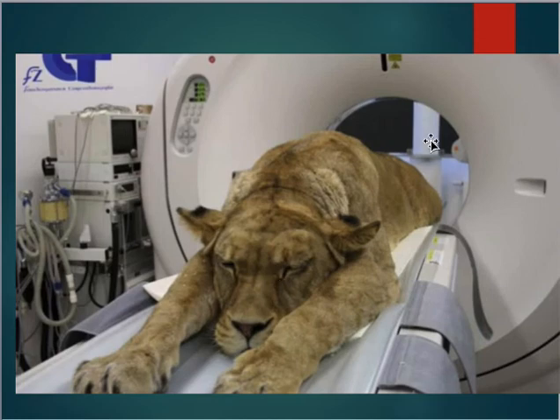Also, if you look here at the opening, which is the aperture, as we call it, they're only a certain size. So in hospitals, we may occasionally have patients who are either too large to fit through the opening, or their weight exceeds what our table will allow, so we can't scan them at the hospital. Unfortunately, in those situations, we refer them to a veterinary hospital like MSU, and they'll use those scanners to scan patients that won't fit in the scanners at the hospital.